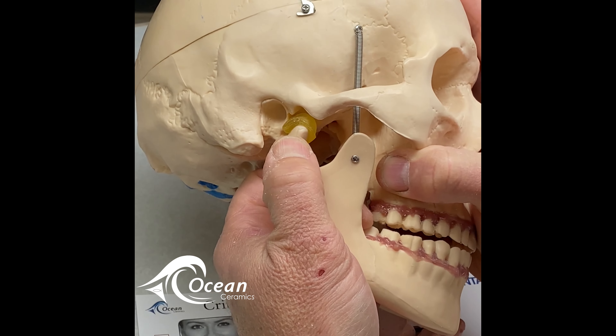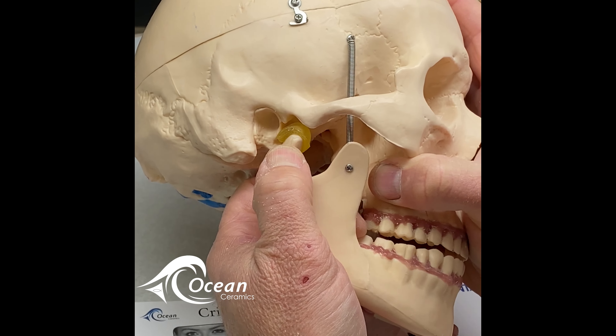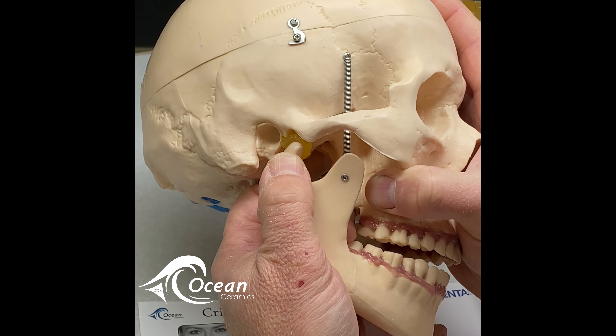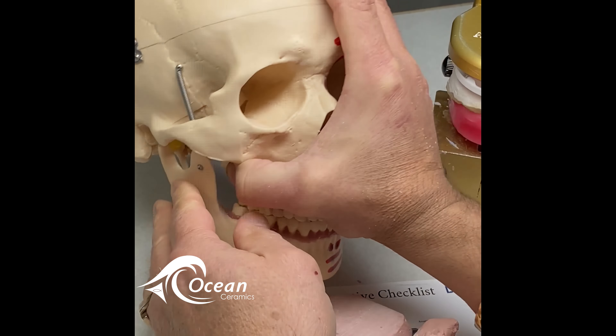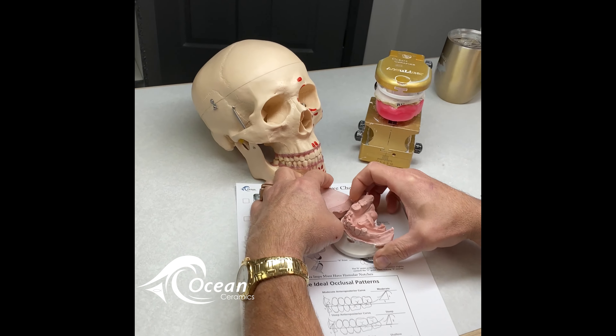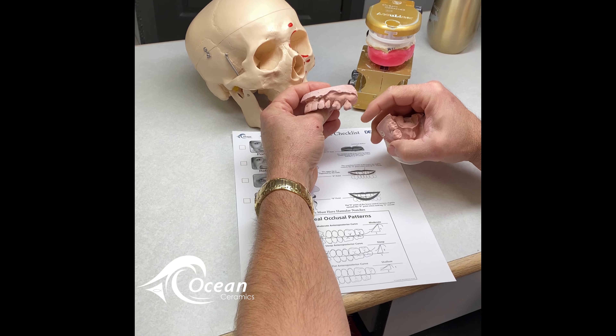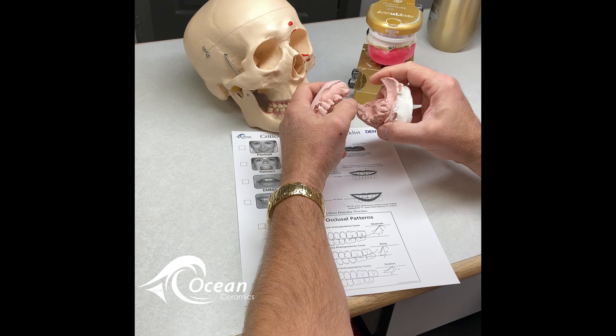Then you make your indication where the midline is. This incisal edge will show you where the incisal edge of the future teeth will be. And then, of course, mark your high lip line. This will dictate and show us how to get a perfect immediate denture every time.